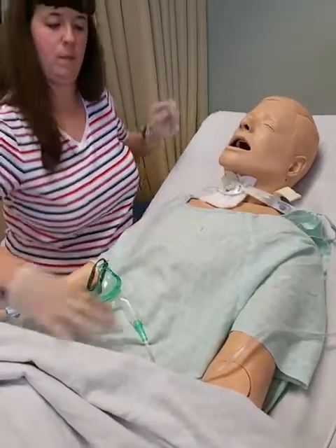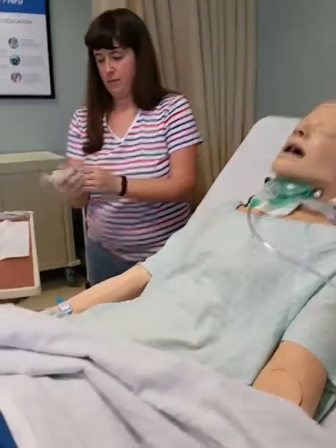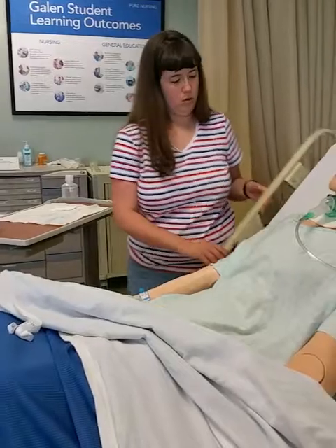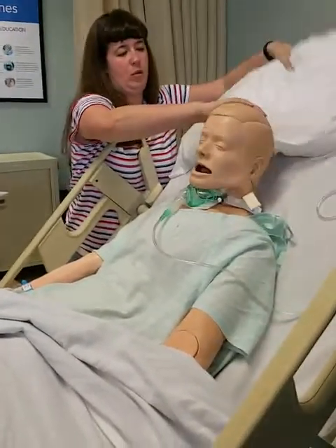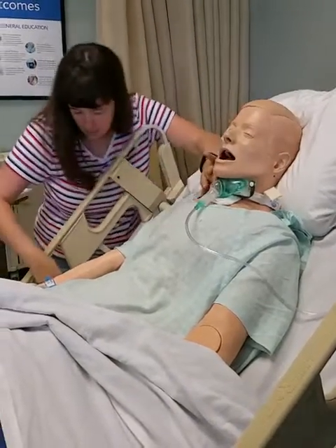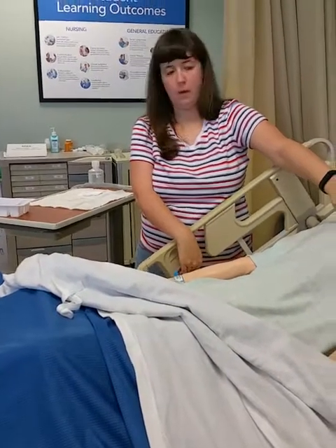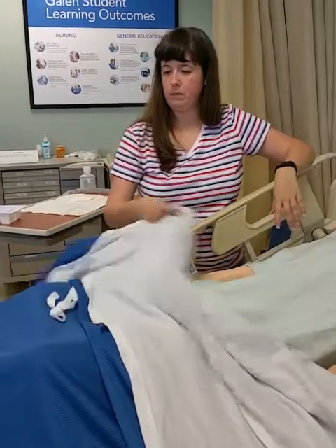Alrighty. That back up. Take my gloves off. I will clean up my mess. Put his pillow back behind his head. Getting back into a position that is comfortable. Make sure he's got his call light. His bed's in the lowest position. Okay? That's trach. Documents.